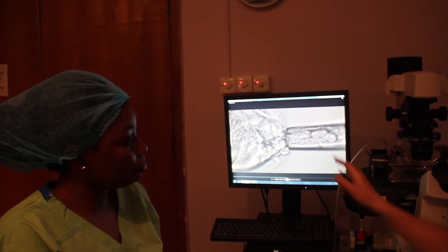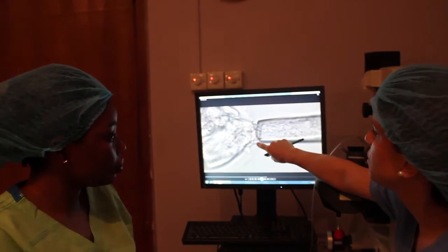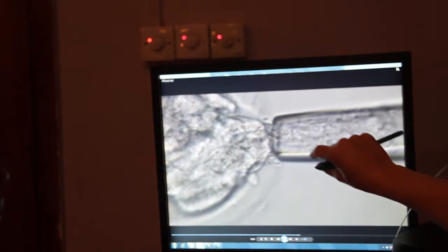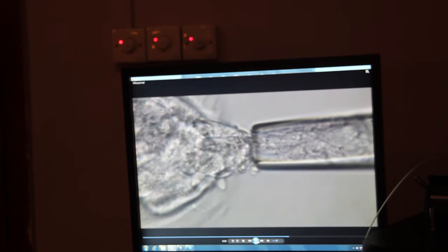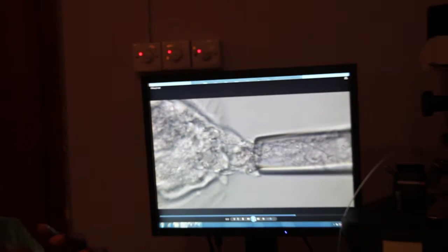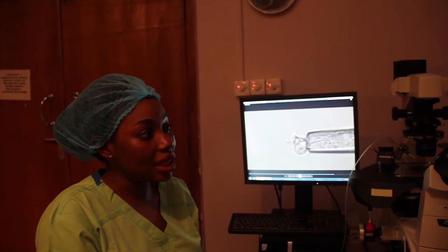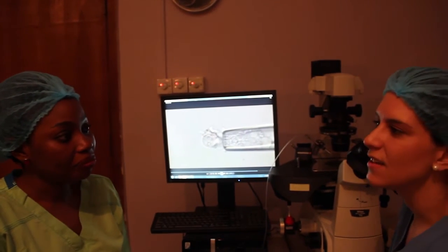Exactly. So we need to aspirate the trophoblast and do the laser shots in the gap junctions of the trophoblast. So this cell will be put inside that tube and finally be sent to the genetic lab, to be analyzed chromosomally. While the embryo itself still stays within the laboratory, it doesn't move, it doesn't have to be transported. It's only a part of the embryo that is being transported from one place to the other. So it's not as if the embryo has to move from one location to the other. We just take a part of it and then send it to another place for genetic analysis. Exactly, for the DNA analysis.